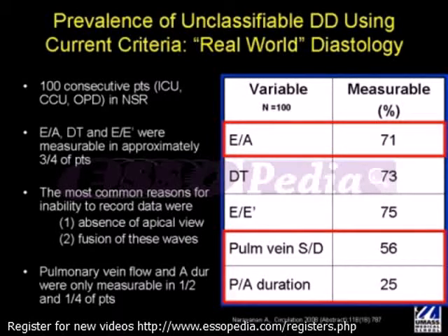So these data suggest the need for a weighted classification scheme, which will incorporate LA structure, LV structure, and importantly, PA pressure. Now keep in mind, in most cases, if your PA pressure is not elevated, then it's very difficult to say that you have elevated mean left atrial pressure. They typically go hand in hand. And work published by Bouchard et al. back in 2007, which is also in the diastolic function guidelines, demonstrated that this is an important measure to include when you're assessing diastolic function.